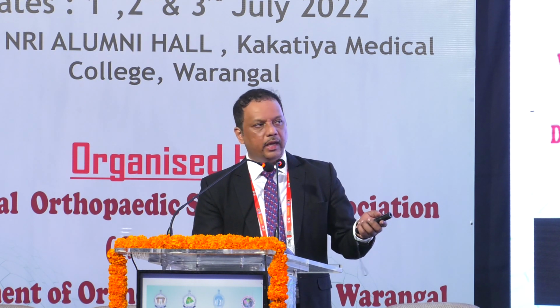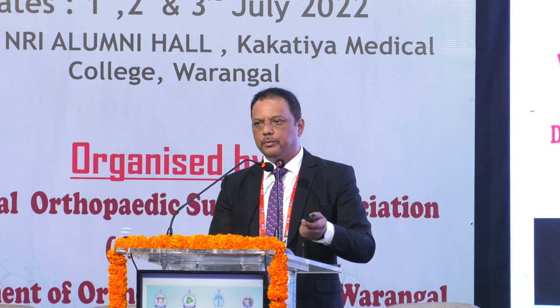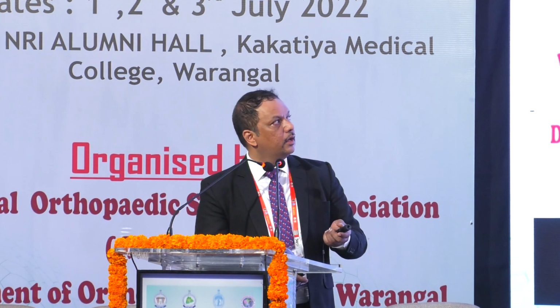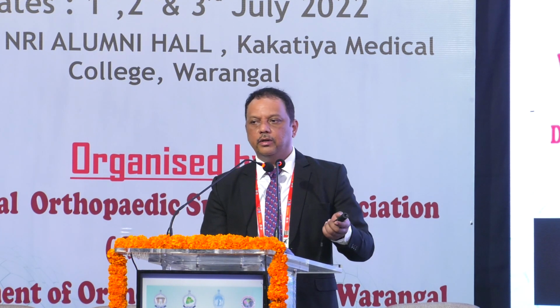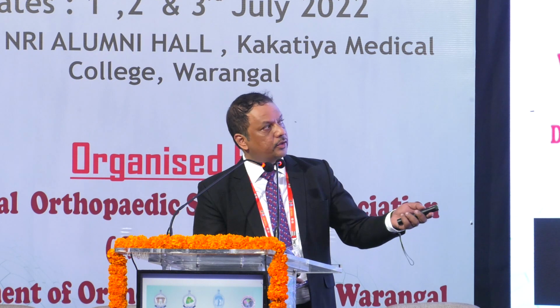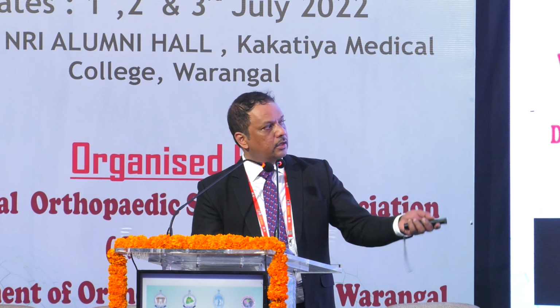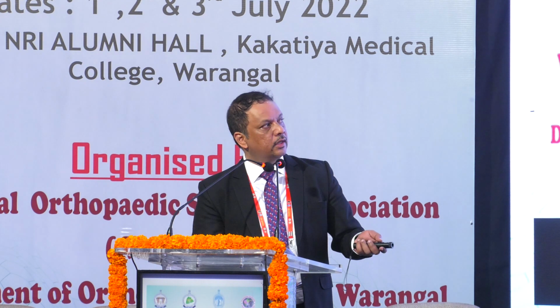If you talk about K-wires, definitely one of the most versatile and most useful implants we have. But again, a lot of times wrongly used or injudiciously used. For comminuted fractures, DRUJ injuries, and also ulnar-sided fractures, they might not be really useful. Classically used for bending fractures like this, especially your good old Colles' or Smith's fractures, right?